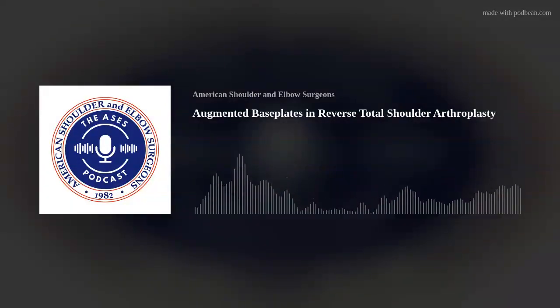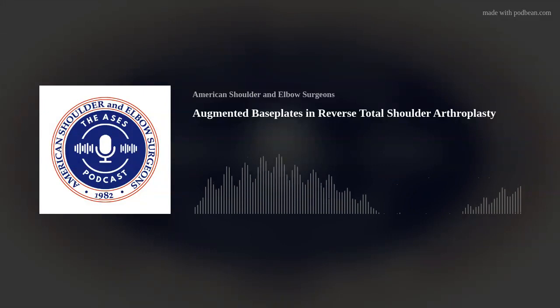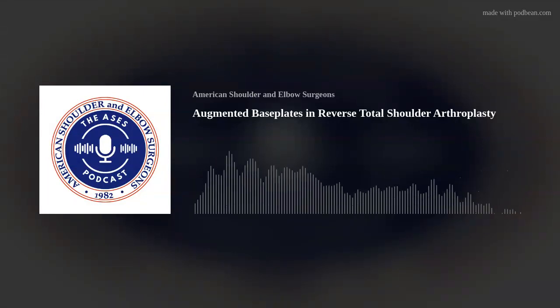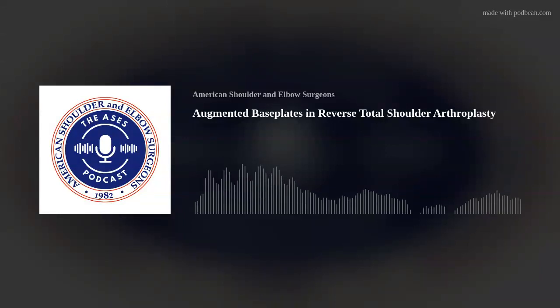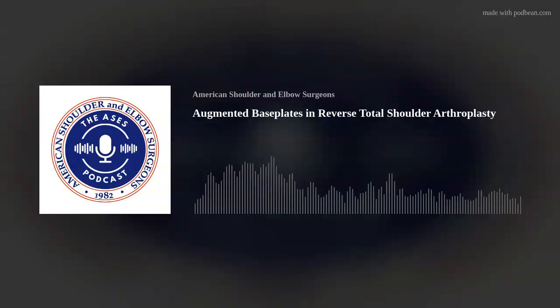But the truth is, I echo what Andy was saying. I get concerned with the poly that has a keel in it. And when I see that on my preoperative CT scan, then I start thinking maybe just standard off-the-shelf components may not work. Most of them can be done with wedges or half wedges, and I've had good success with that.